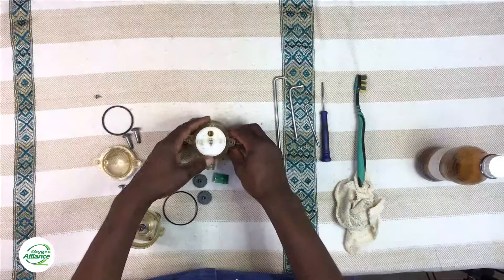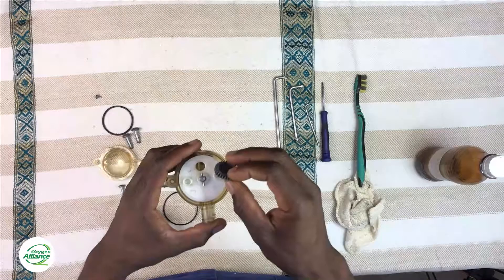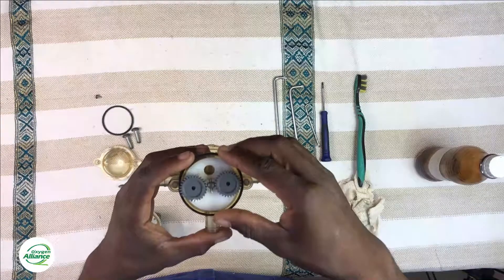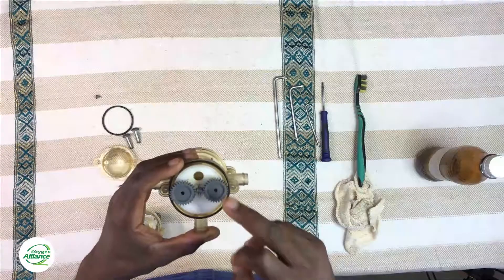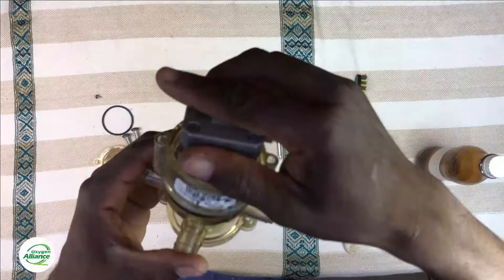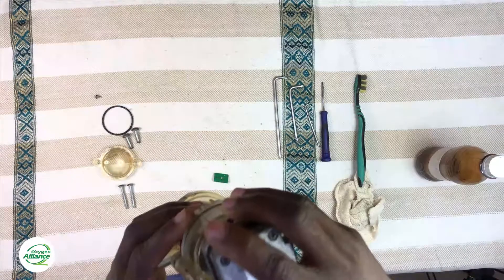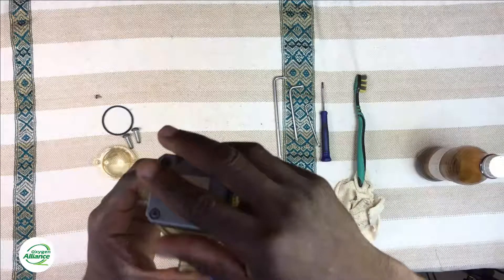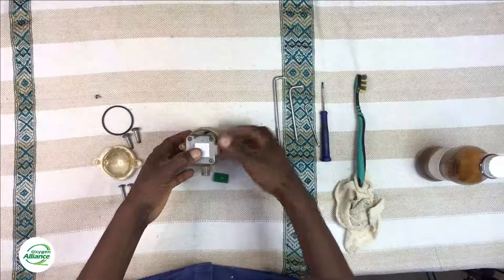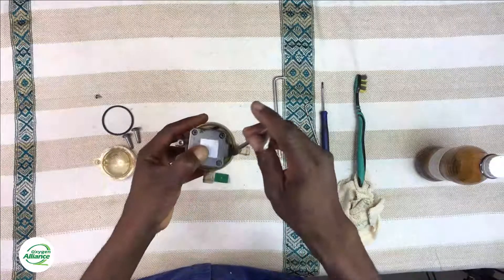After you tighten that, move on to putting back the gears and the o-ring on the other side of the stepper motor. Once you replace the gears, get the stepper motor and put it back on top, making sure the gear connected to the stepper motor slides nicely into the gears inside the housing. Once everything is in place, replace the screws that hold the stepper motor to the valve housing.